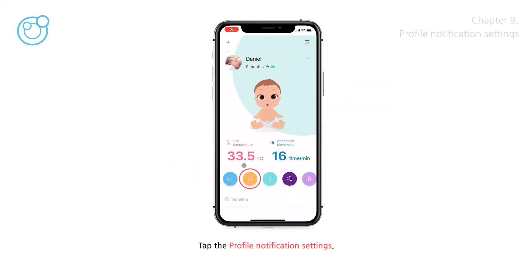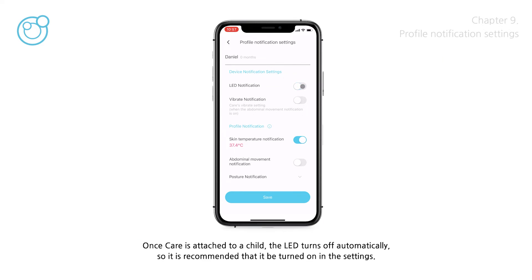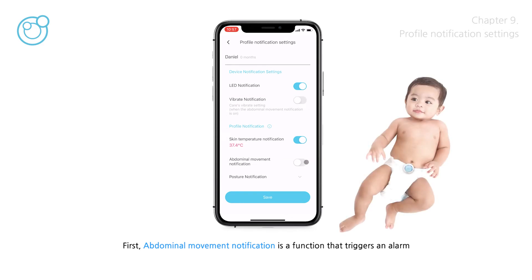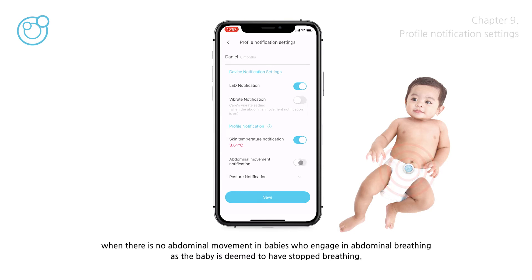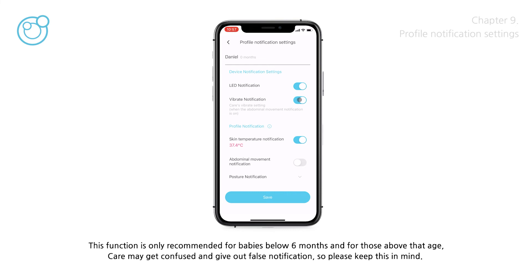Tap the profile notification settings. LED notification is a function that can turn care's LED lamp on and off. Once care is attached to a child the LED turns off automatically, so it is recommended to turn it on in the settings. Abdominal movement notification triggers an alarm when there is no abdominal movement in babies who engage in abdominal breathing, as the baby is deemed to have stopped breathing. The vibrate notification function causes care to vibrate to wake the baby up, and only functions when there is no abdominal movement. This function is only recommended for babies below 6 months — for those above that age, care may give false notifications.